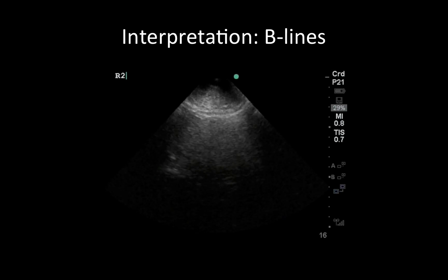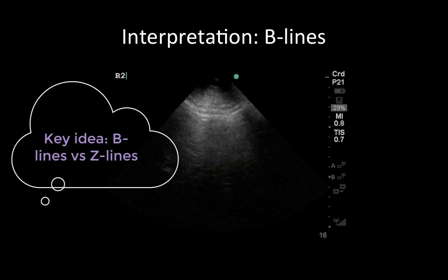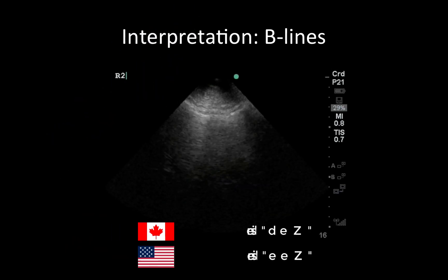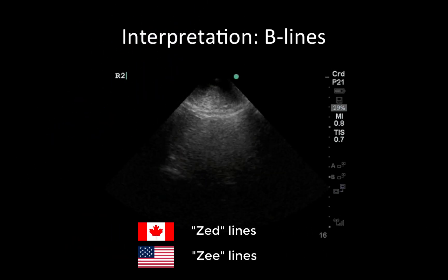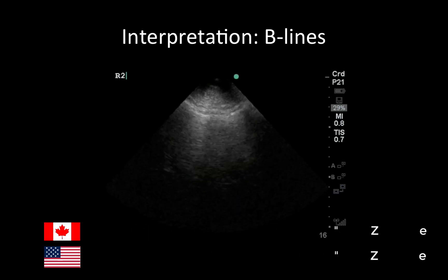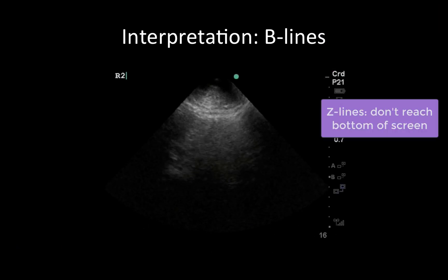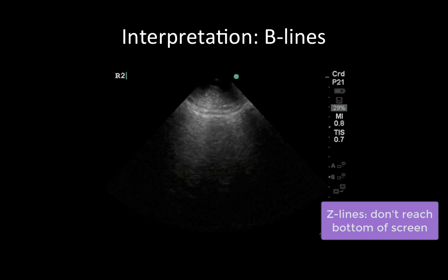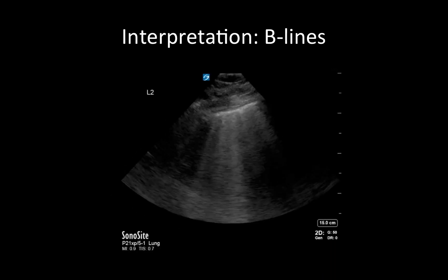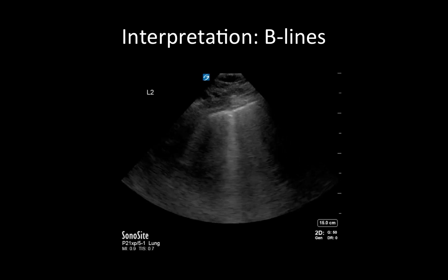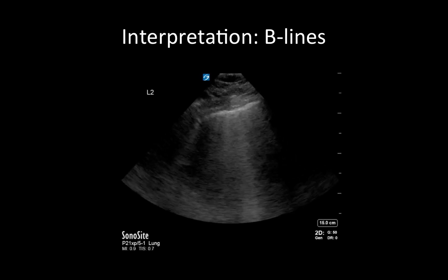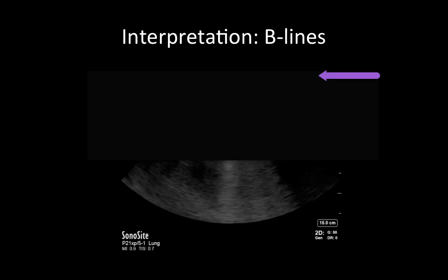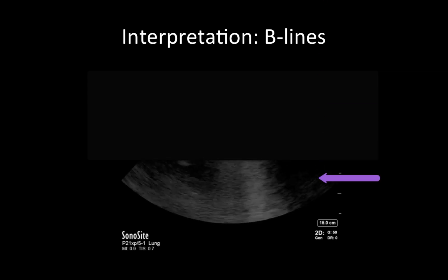In the interpretation of B-lines, one common mistake is to confuse B-lines with Z-lines. Z-lines are vertical artifacts that emanate from the pleura but do not travel the entire depth of the screen. Their exact physiologic correlate is unknown, but they are not pathological findings and should not be mistaken for B-lines. If you're ever unsure, increase your depth and focus on the bottom part of your image to see if the vertical artifacts do in fact extend the entire depth of the screen.